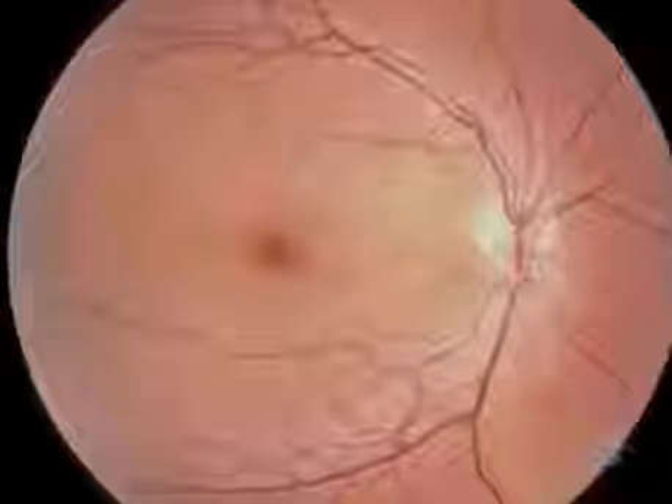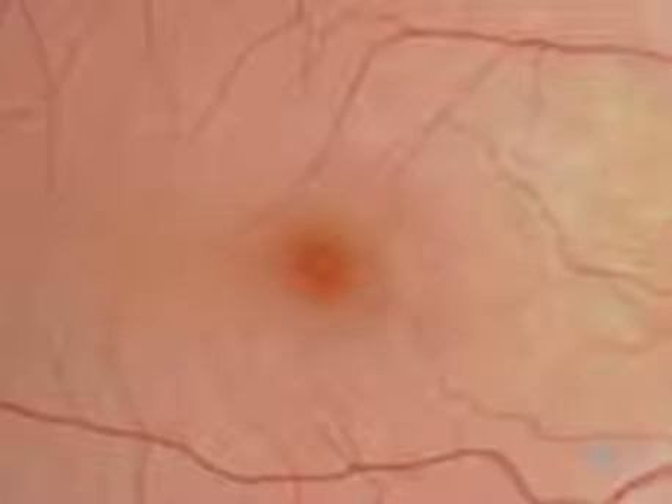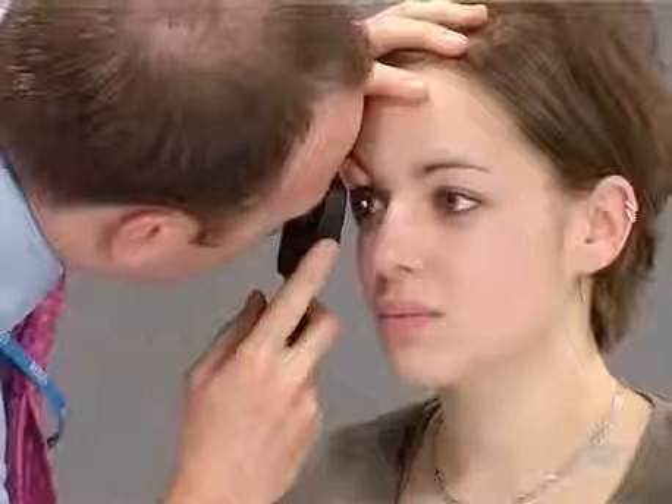As the final part of fundoscopy, you should examine the central retina lying inside the vascular arcades. It contains the macular region and the centrally located fovea. To bring the fovea into view, simply ask the patient to look directly at your light. Some patients will find this difficult to tolerate, which is why it's best left until last.